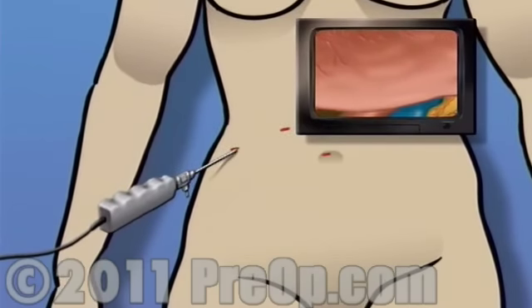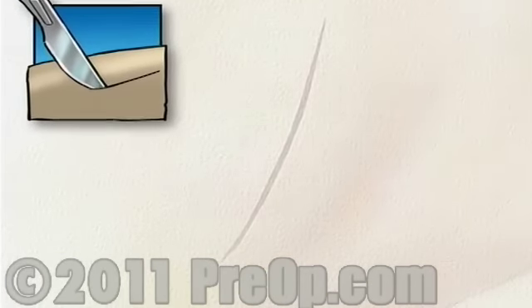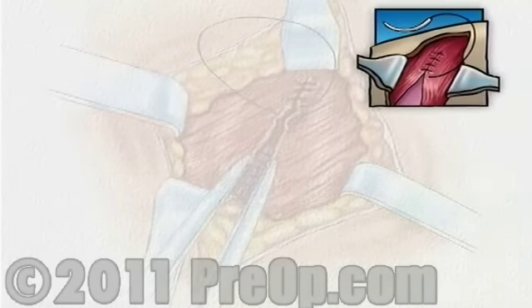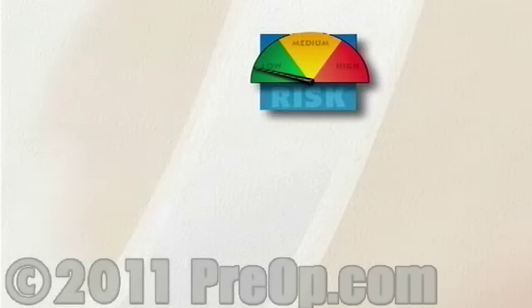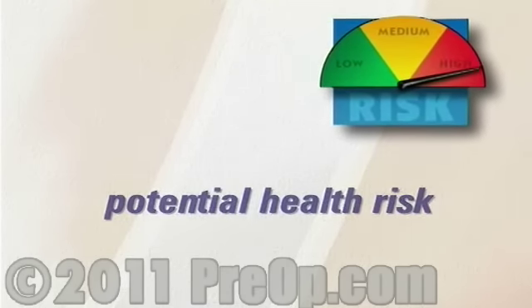However, it is important to understand that during the procedure, your surgical team is always prepared to convert a laparoscopic procedure to an open procedure, should they feel that your condition requires a more direct approach. If the surgical team makes this decision, you will find upon waking up that your doctor has made a larger incision and that healing may proceed more slowly. Converting to an open procedure will affect the length of your recovery and will probably require hospitalization. Of course, no surgery is completely risk-free, but your physician believes that if you decide not to undergo the recommended procedure, you may be putting your health at risk.